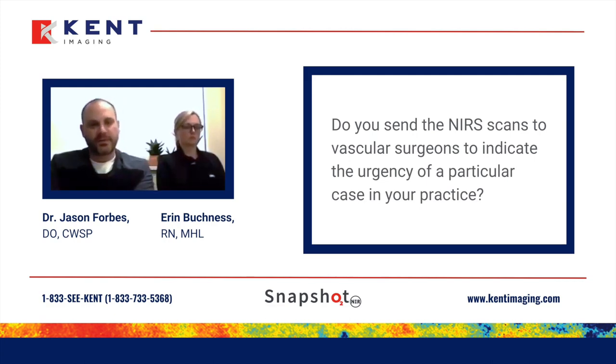Yes, and that's one of our major uses for it, and one of the major selling points. Instead of calling a vascular surgeon and saying, I might feel a pulse, but it's pretty weak, and the cap refill is a little bit delayed, and they've got all these other comorbidities, and I'm concerned about them. Well, they get that same phone call probably 20 times a day from primary care offices and from inpatient hospital where they were admitted for congestive heart failure, and they're just concerned. Well, this is more than concern.